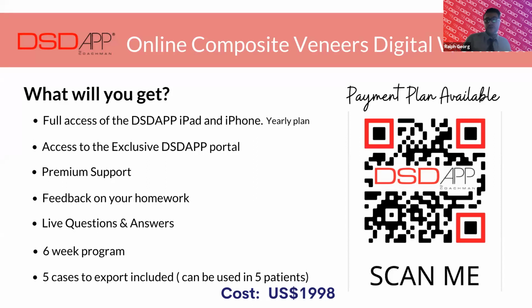Because we're going to be very much hands-on, and it's going to be Dr. Diogo and a number of team members there to help with any questions that you have throughout every step of the way. And you get the 5 cases to export, which is huge. Dr. Diogo, talk a little bit about the 5 cases, how that works.